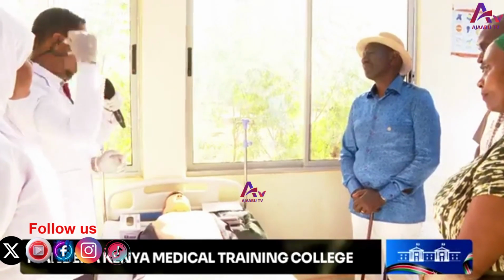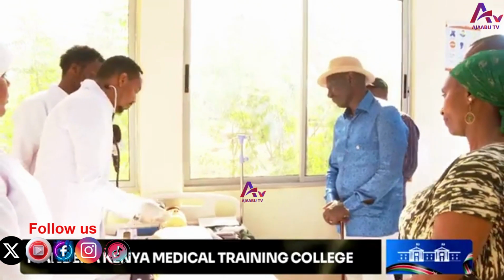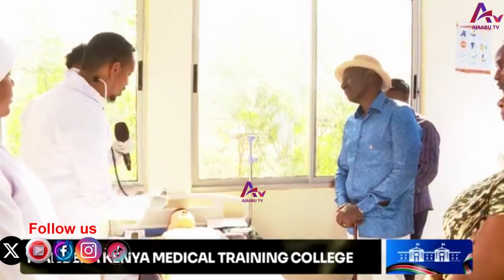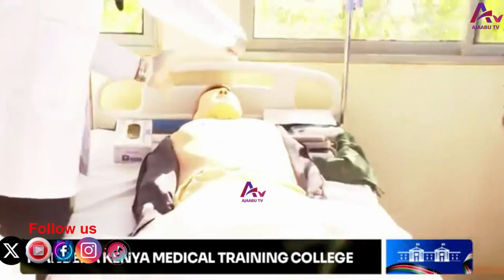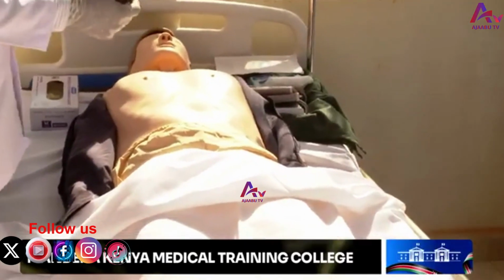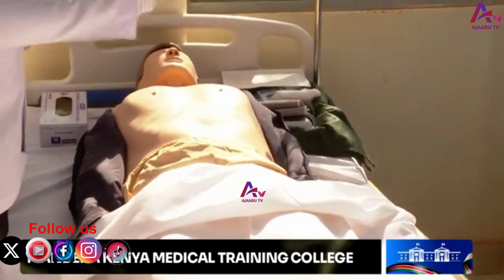From percussion, now we go to auscultation. Auscultation is where we use this stethoscope. When we are using the stethoscope, we use the diaphragm of the stethoscope. Again, we place this on the place where we did the percussion, that is still the intercostal spaces. When we are doing this, we check for bilateral air entry. We check if both lungs are receiving air entry bilaterally. Then from there we go to the breath sounds, whether they are normal or abnormal.